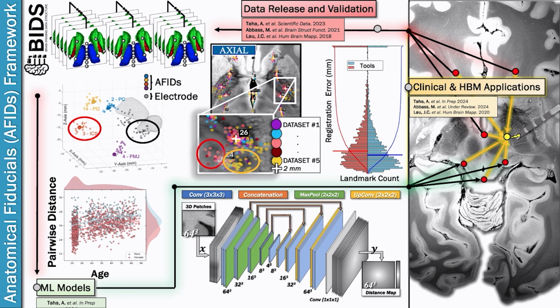Yeah, that's a great question. The question is, if the human rater can place these points with an accuracy that ranges between 0 to 2 millimeters, and this is actually the inter-rater accuracy, so if you and I place the points on a scan, the inter-rater error would be 2 millimeters, and if humans place these coordinates with that accuracy, how can I claim that the model performs a bit better than that? The answer is twofold.